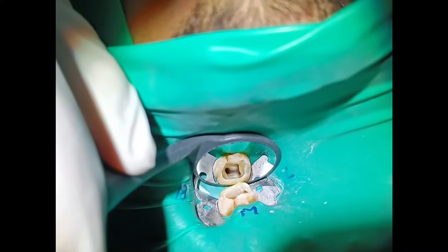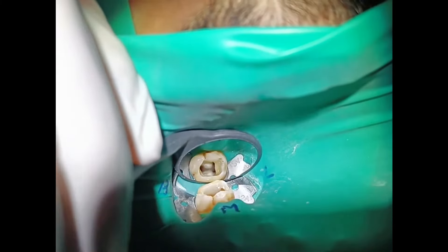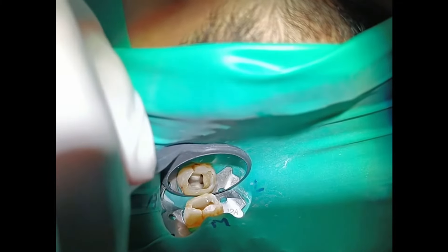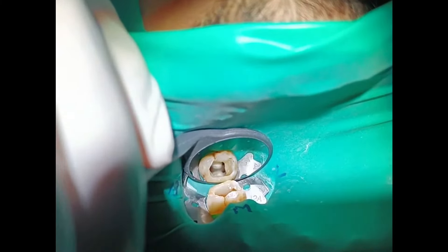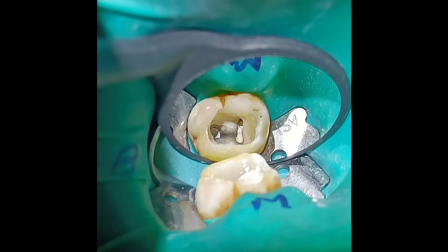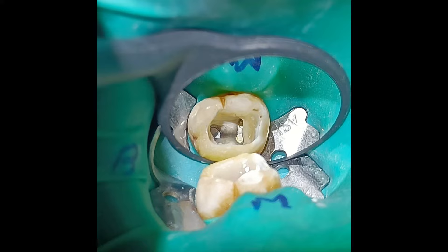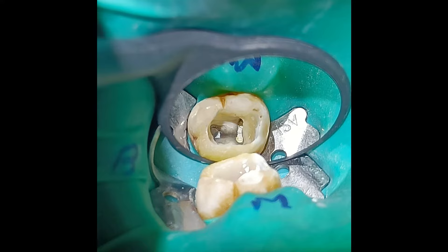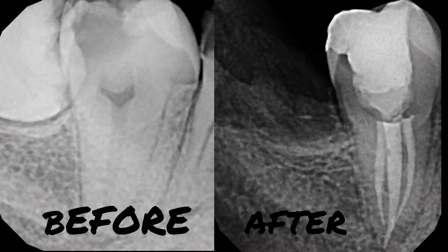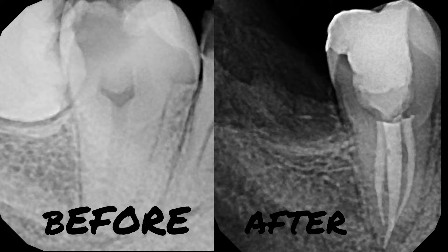So I went with my instincts and here I am — without any perforation, beautiful canals. See you then. Thank you.